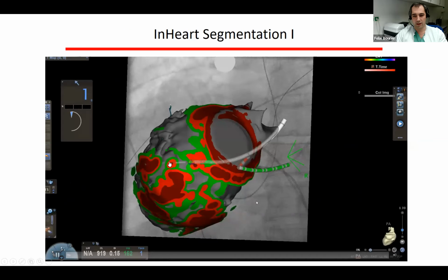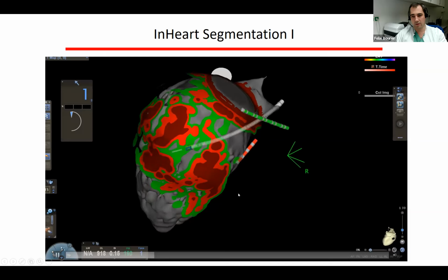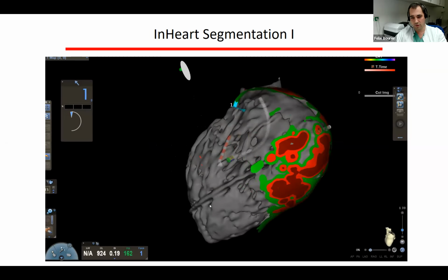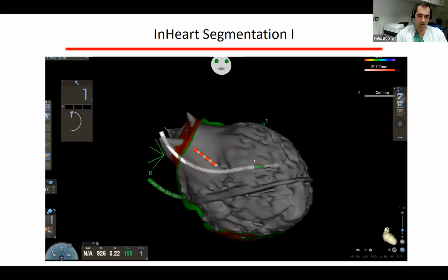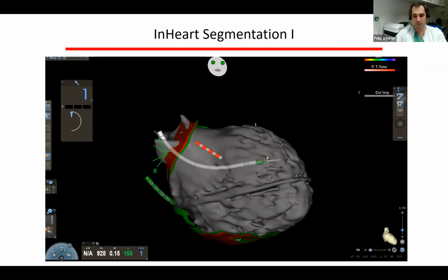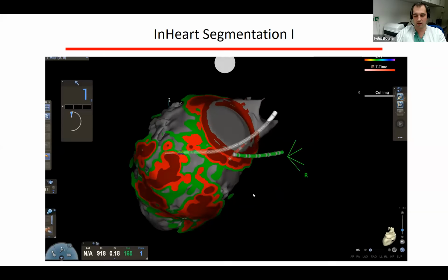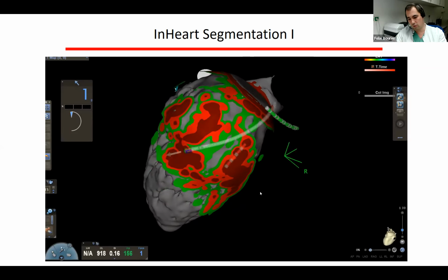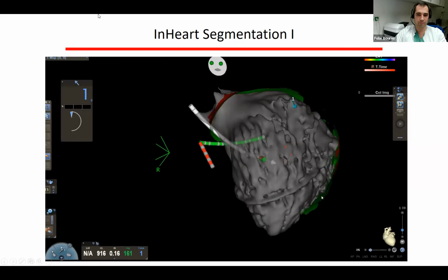And on the next slide, let's directly pass on to what the inHEART segmentation of this patient showed us. Again, like in the previous case shown by Florian, this is one with a progressed DCM, especially in the inferior aspects, maybe post-myocarditis. You see the septal and apical part are not affected, but in the inferior part from basal almost to apical, we had these findings.